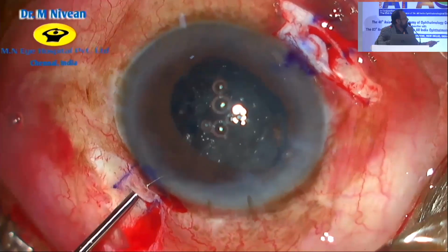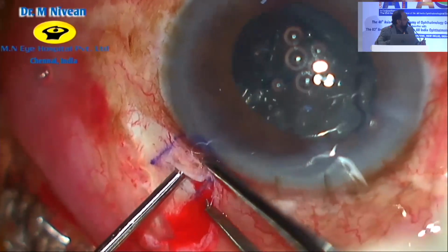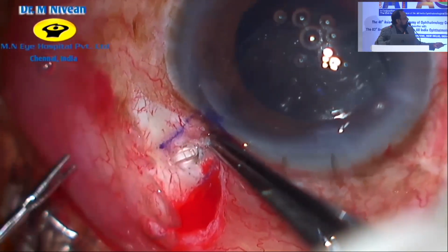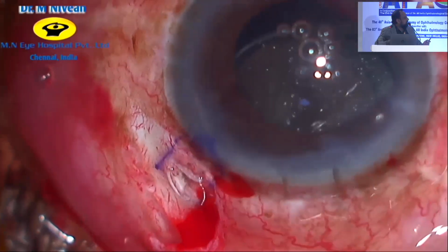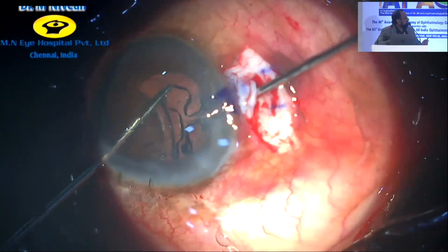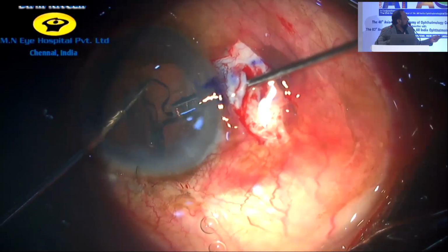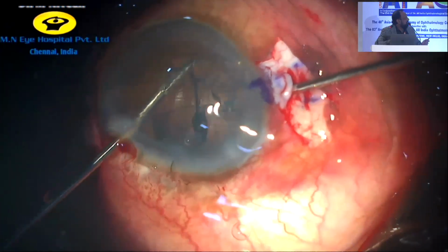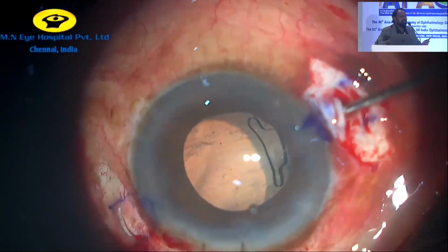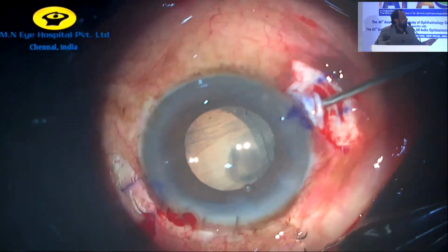So again, now once the lens is injected inside, I always just open the flap to make sure I have the tug and I'm able to see clearly. That's why I lift the flaps before I pull the T junction out. Here again, exchanging the other hand, grabbing either the head or the neck, either way, and they are relatively flexible, so less intraocular damage to the tissues also. And they have a good stretchability also.